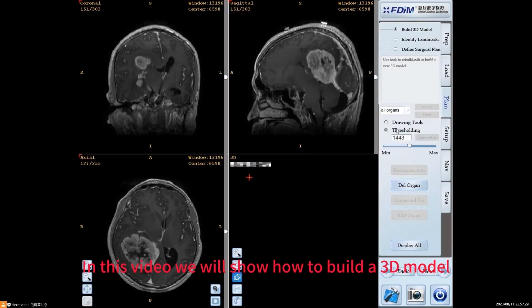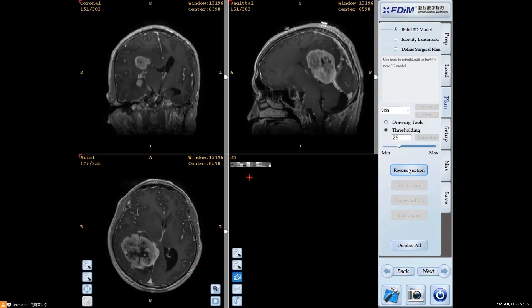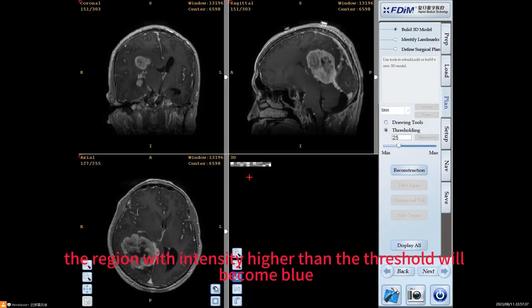In this video we will show how to build a 3D model. The skin model must be built. Click this button.